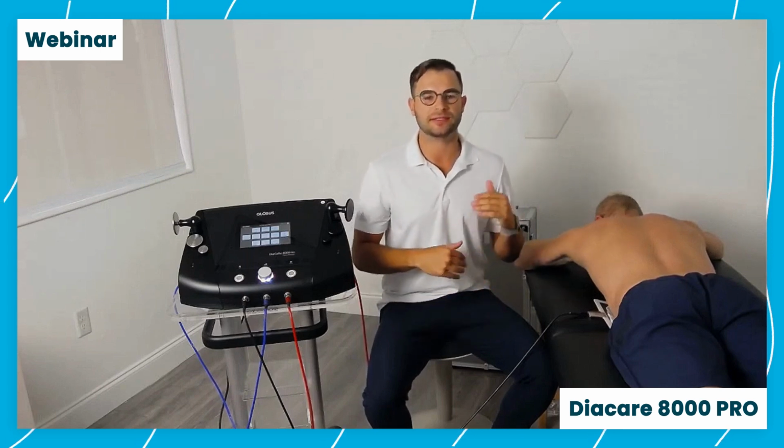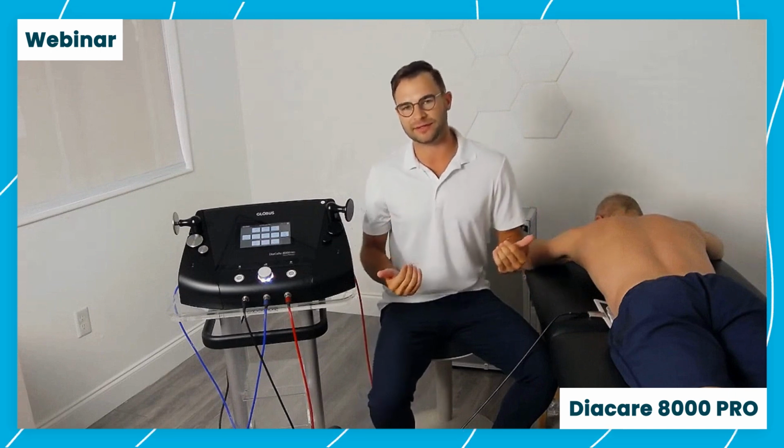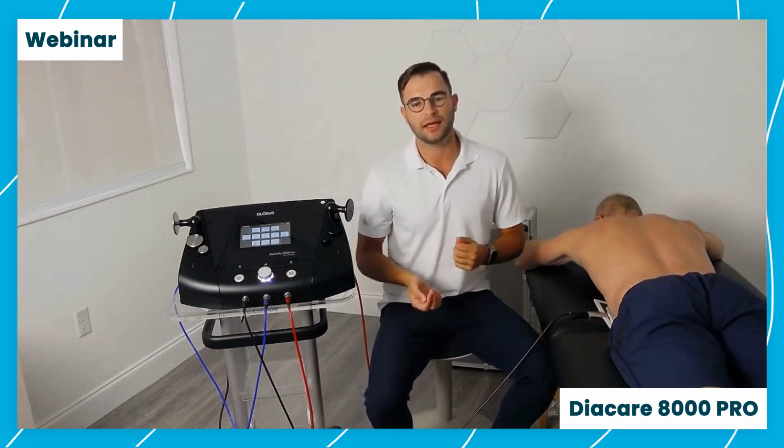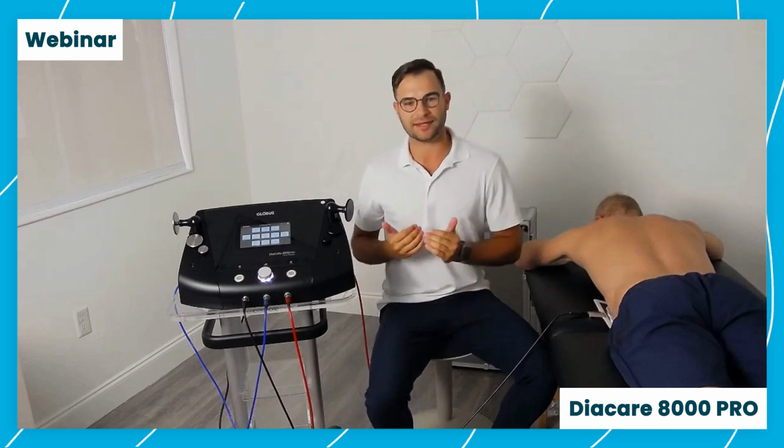The frequencies, which ones are we going to use? Why are we using a lower frequency versus a higher frequency? Again, we can kind of cheat the system. We can think of it as a 400 is a deeper treatment versus a 1200 is a very superficial. And then the intensity. What intensity are we using? What stage is this patient in the healing process? And that's how we're going to dial it in.